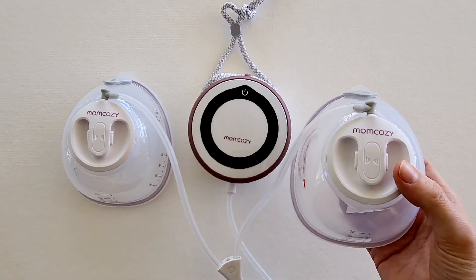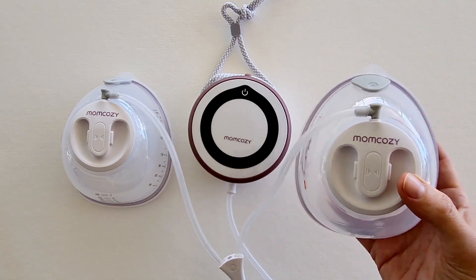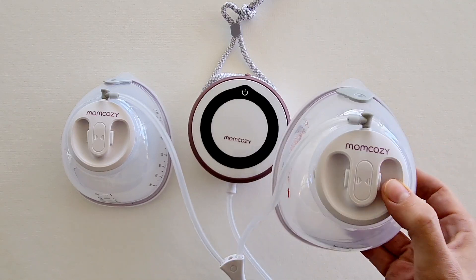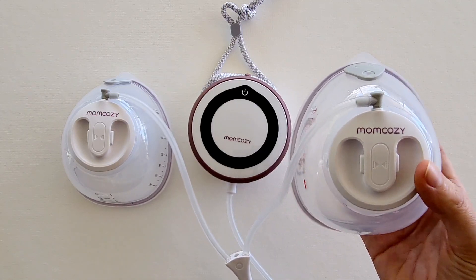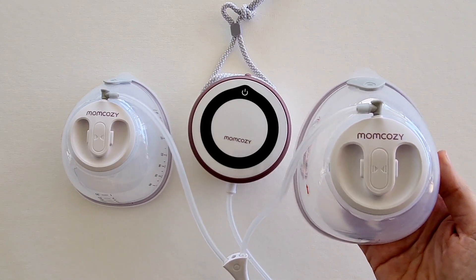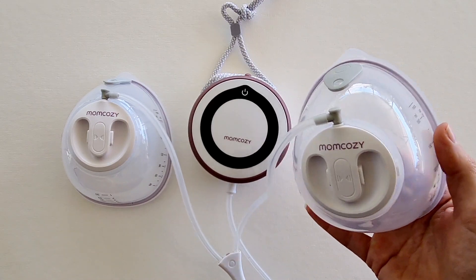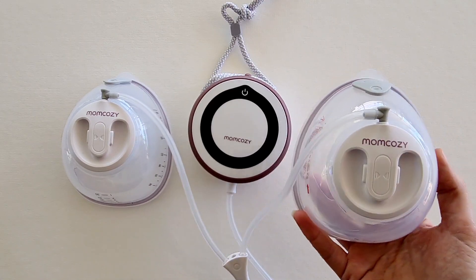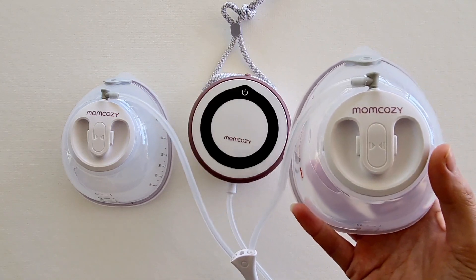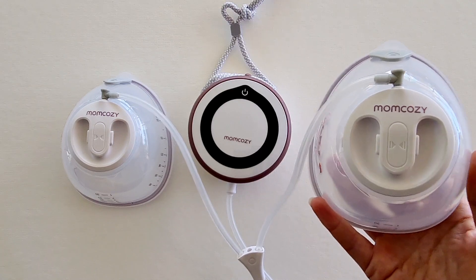Let's start with a few of the things that I absolutely love. This is a hospital-grade suction — it is up to 290 millimeters of mercury, so this is a powerful pump, especially for a wearable breast pump. What I love more is that you have nine different suction levels, so you're able to adjust the settings to your comfort levels, which is always a huge plus.